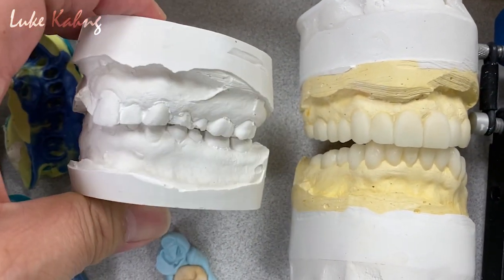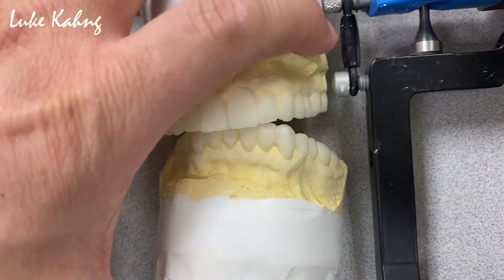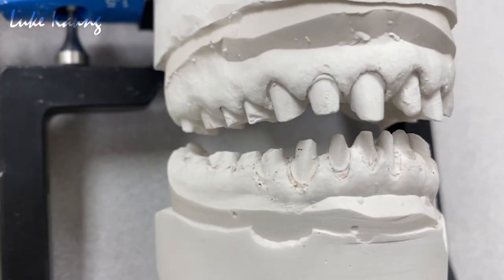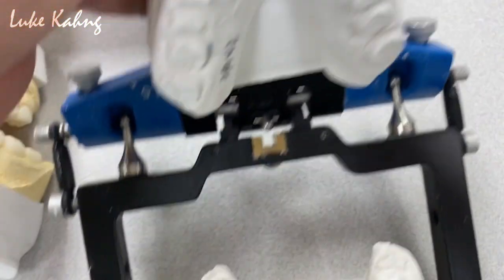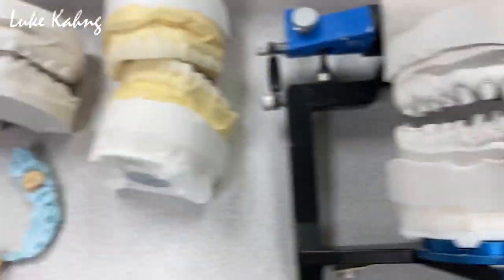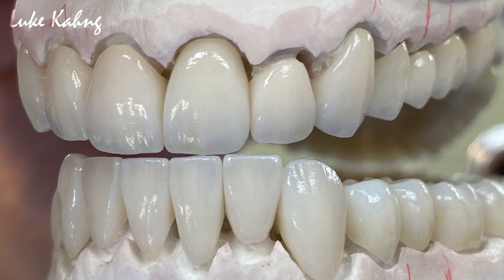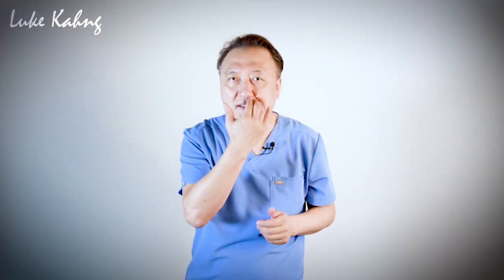After we wax up, we measure it. It's perfectly matched, which is great. So this is 28 teeth, and we're trying to finish with the zirconia. The dentist made it with the temporizations, and it looks good. So he took the old, prepped the teeth, and then we fabricated the final zirconia restoration. For the back teeth, we made translucent zirconia, and then here we layer porcelain, creating aesthetics as much as possible.